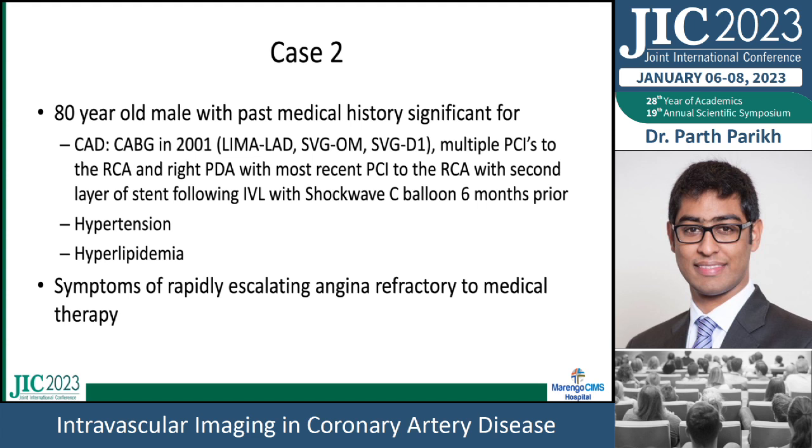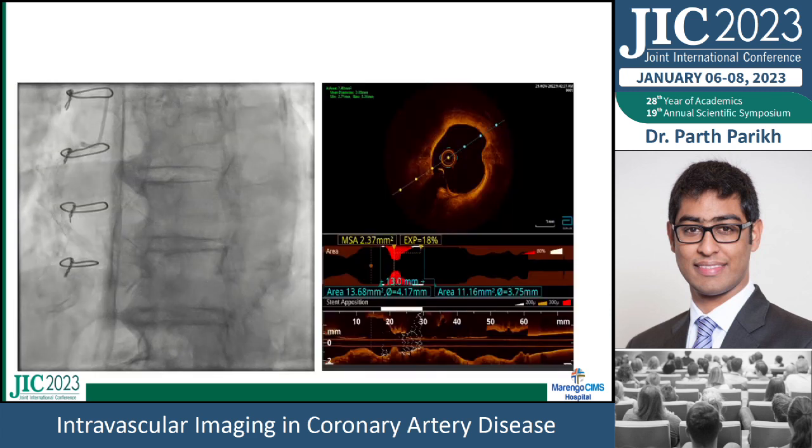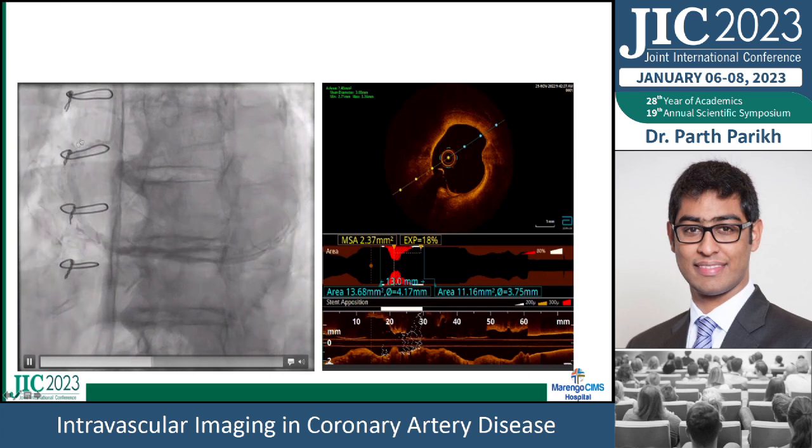At that time, they had done intravascular lithotripsy with a shockwave balloon, and he also has hypertension and hyperlipidemia. He had rapidly escalating anginal symptoms refractory to medical therapy and comes in for heart catheterization. I'm just going to go over the vessel of interest, where you can see that there's calcification.